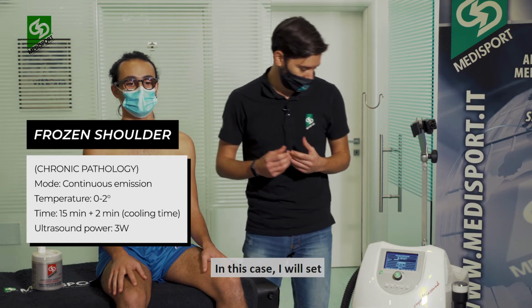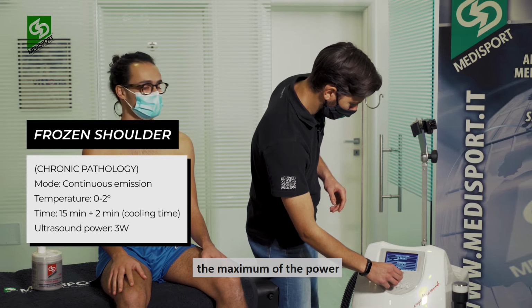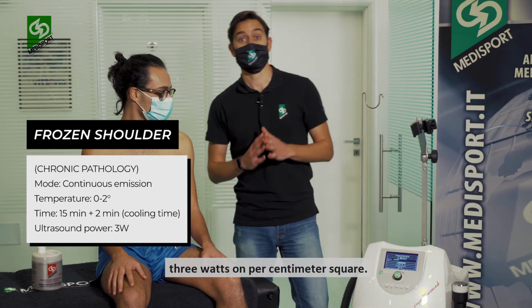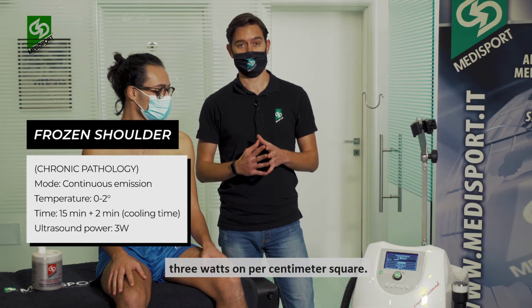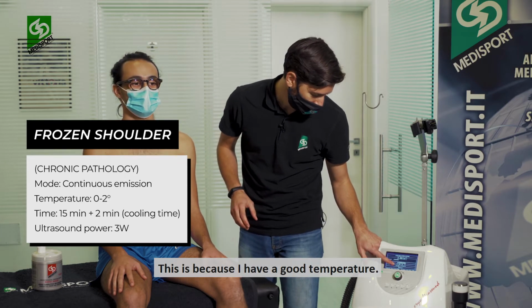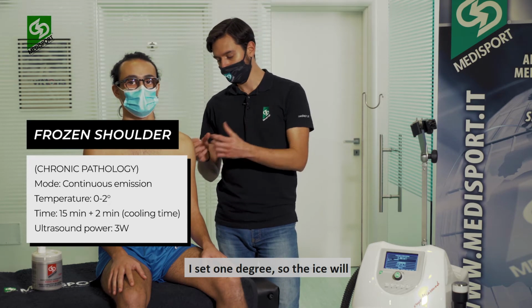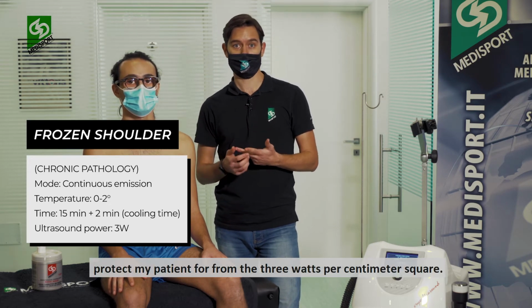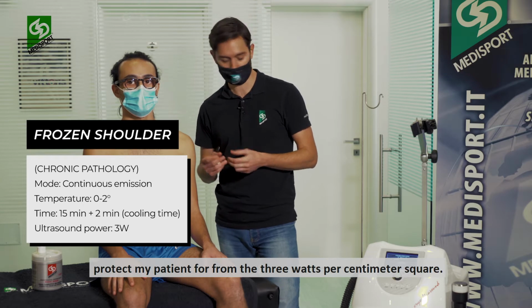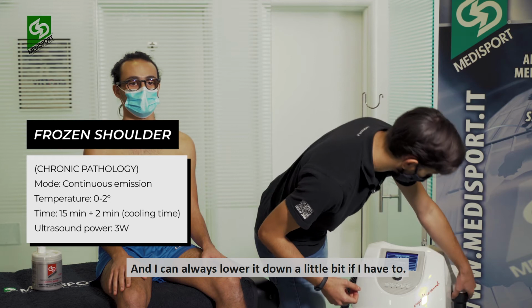In this case, I would set the maximum of the power, 3 watts per centimeter square. This is because I have a good temperature. I set 1 degree, so the cold, the ice, will protect my patient from the 3 watts per centimeter square, and I can always lower it down a little bit if I have to.